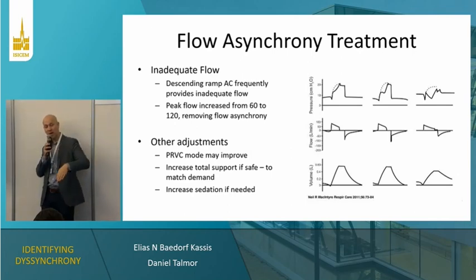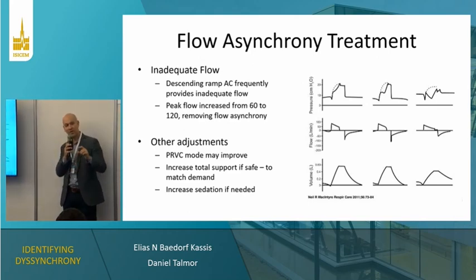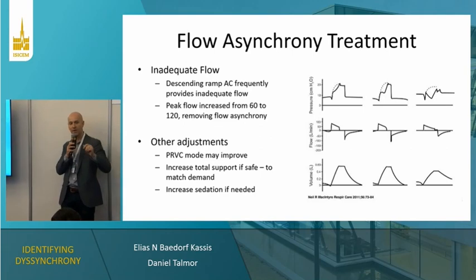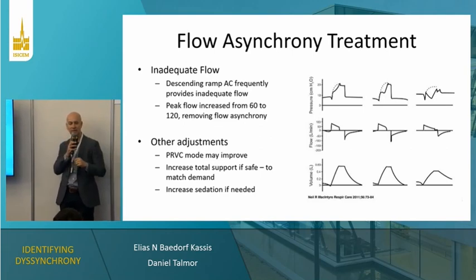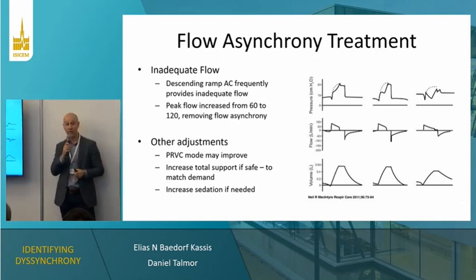So if you have a big drop in your pleural pressure, you may see the sucking of the airway pressure too, which means the pressure across the lungs, the transpulmonary pressure, may not be quite as bad as you might expect. However, it's still going to be magnified because of those high efforts, not just distending the lungs itself, but also trying to draw pressure down the airways too. So you will have a magnification of transpulmonary pressures through flow asynchrony, but it may not be quite as bad as you might expect with this.